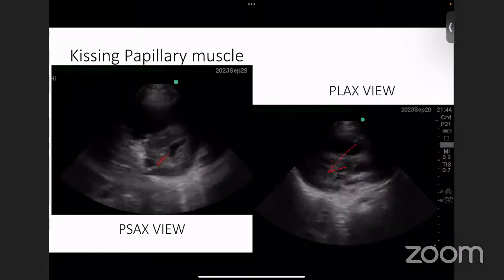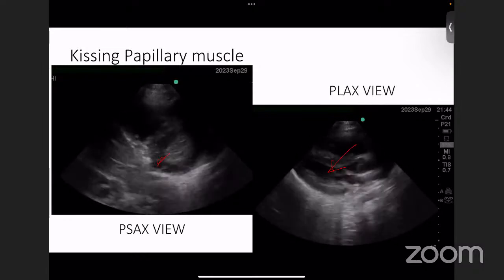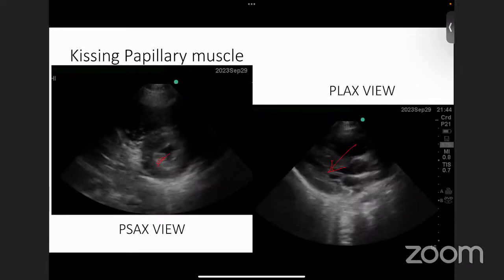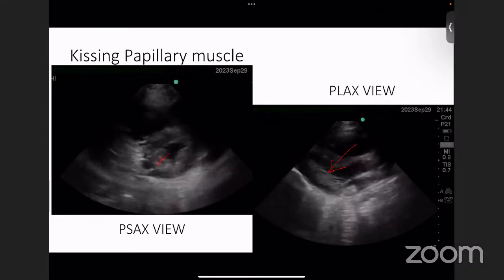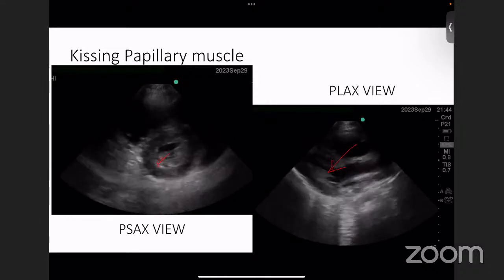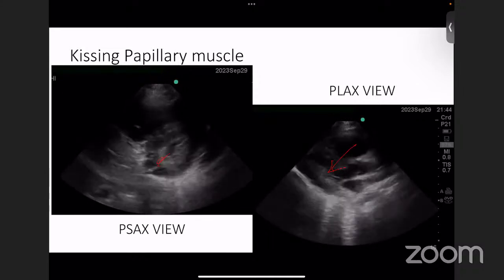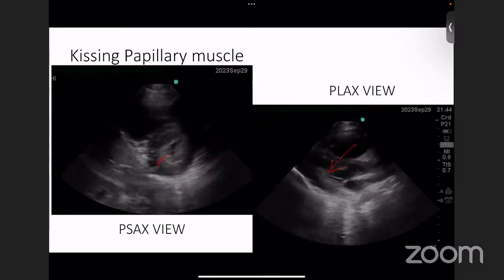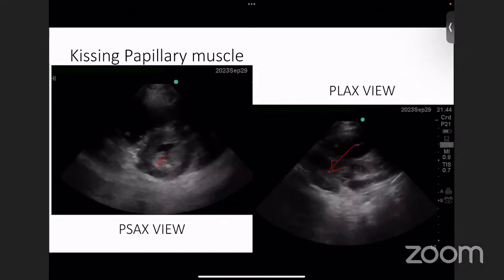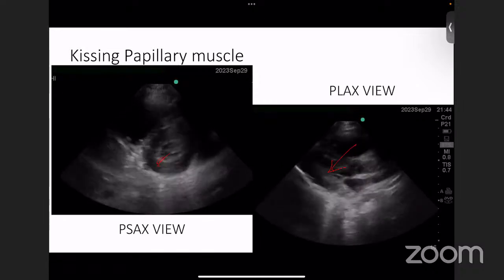This patient was shifted from another hospital, with hypotension, with almost 10 ml per hour single strength adrenaline going. So how can you expect the BP to improve when the tank and the tubes are empty? So basically we have to give fluids. If you increase the pump with the noradrenaline, it's not going to help unless the tank is full. So this is how bedside echocardiography will definitely help you to assess the fluid status of the patient.